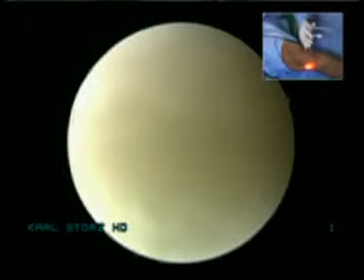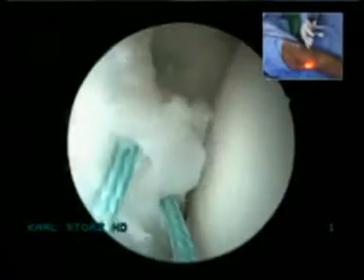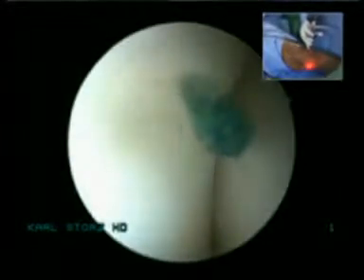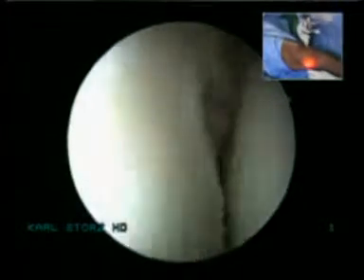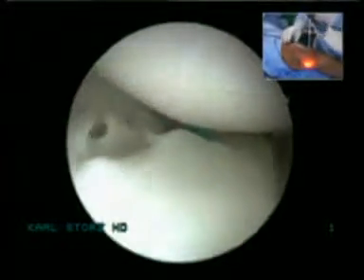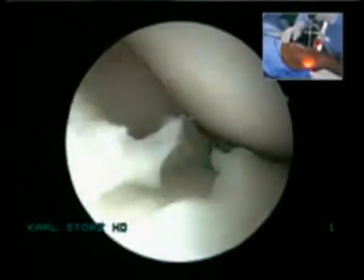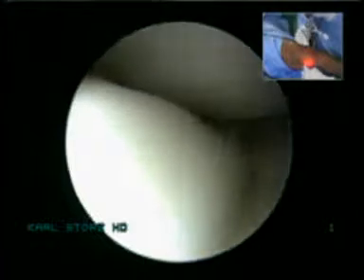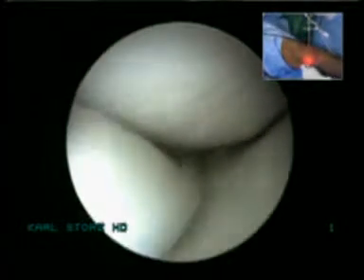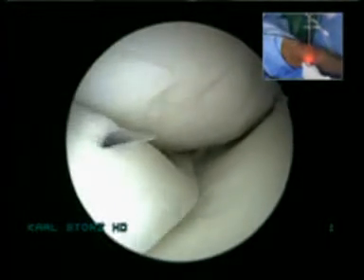Inside-out as opposed to outside-in. Okay. But I think you've got to try and preserve as much meniscus as possible. True. So we have a very interesting meniscus session coming up, so all the people who are interested to learn the art of meniscal repair can attend that. I think further details would be available with the Smith and Nephew stall. There are broadly three types of meniscal repairs that you can possibly do. Fast fix refers to an all-inside method of fixation. And right now, I think Dr. Wolf Peterson is doing an outside-in.